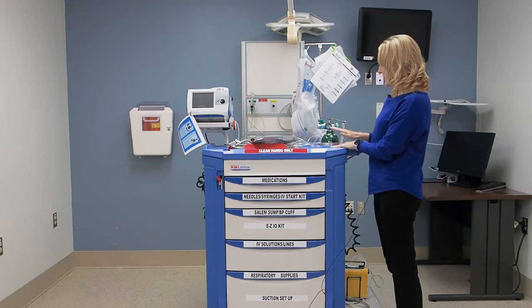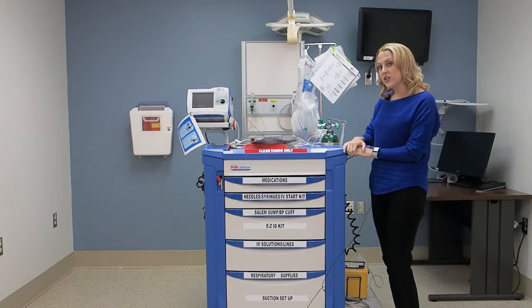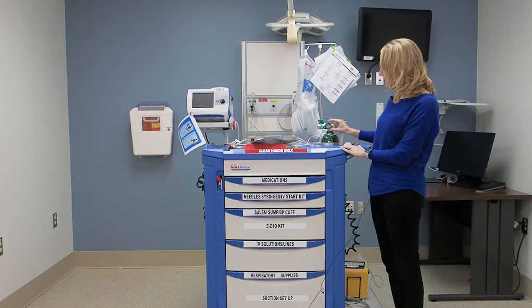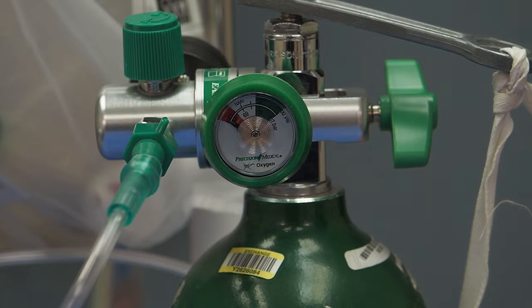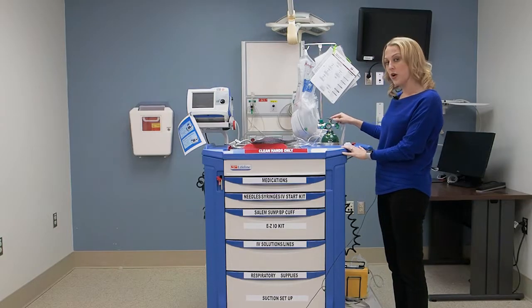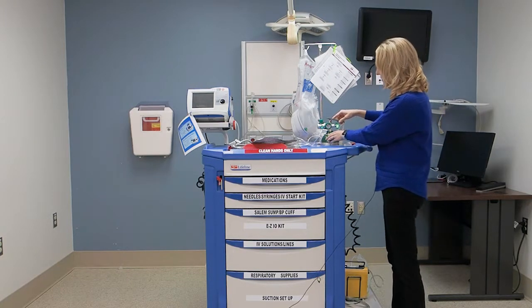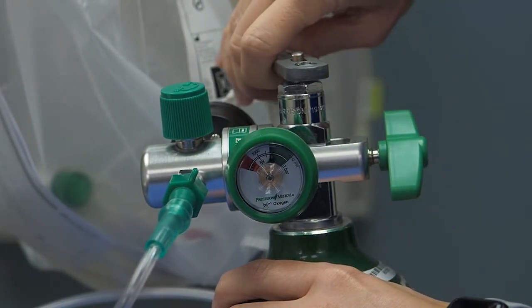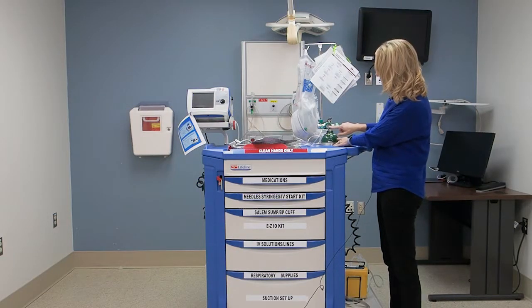Next, we're going to look at the oxygen tank. One of the things that I think is important to note is that when you look at the indicator of how full the oxygen tank is on any crash cart in the facility, the arrow should be in the red. That's what it should be. What you need to do is turn the wrench that will open and close the valve counterclockwise to open the valve. When you do that, the arrow is going to move up into the green. It should be in the green if it's full.